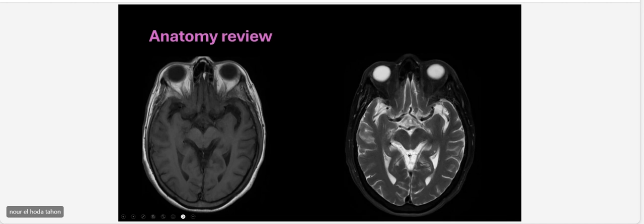There's also a part of the basal cistern you can see here, and yeah, this area is the suprasellar cistern, and actually it has part of the optic chiasm, if you can see here. I know these are fine details for you, but you can just imagine.